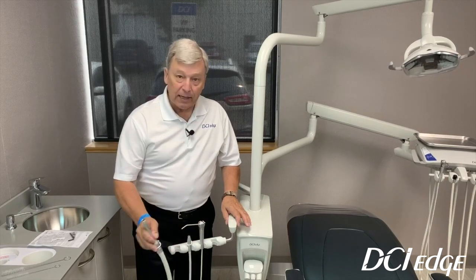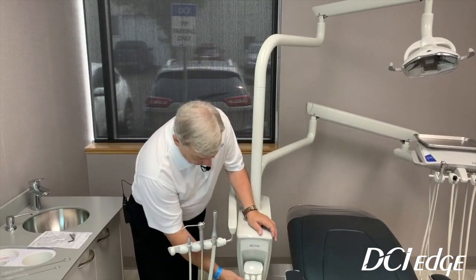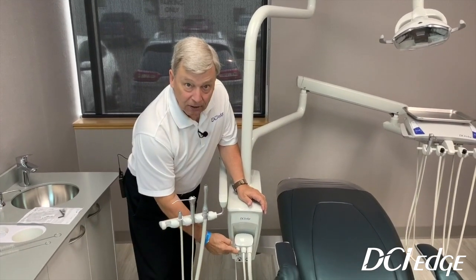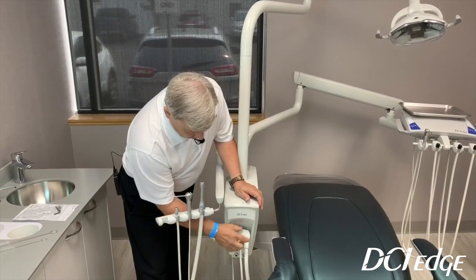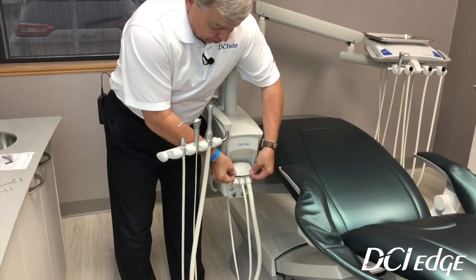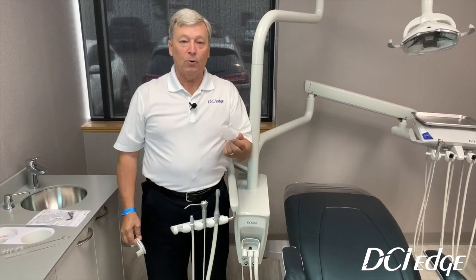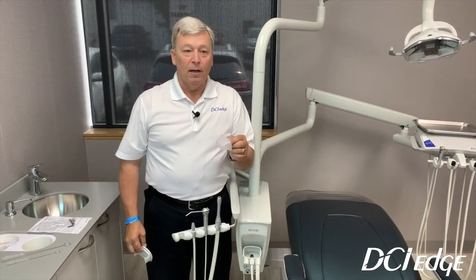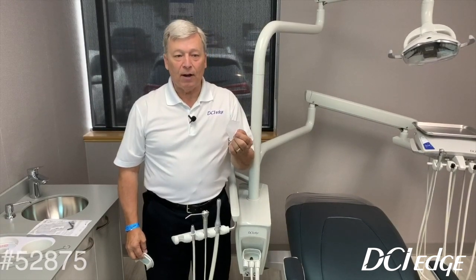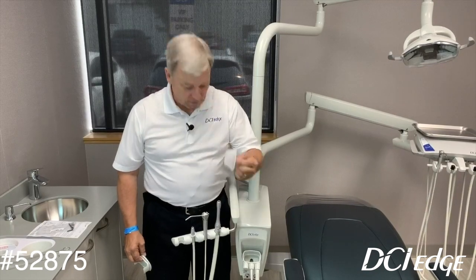With each of these, you can always add a second HVE valve just by ordering the part from your dealer, and it will plug directly into the collection canister. On the collection canister is where the vacuum trap is located. If you lift the lid up and pull the screen out, it can be tossed away and you can put a new one in. The part number for these disposable traps is 52875.